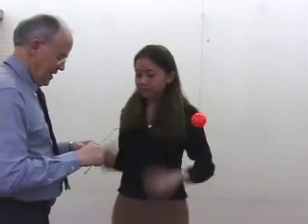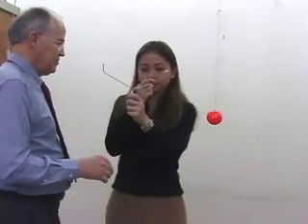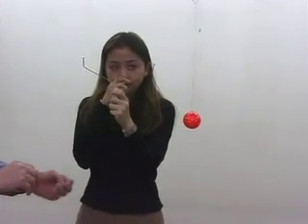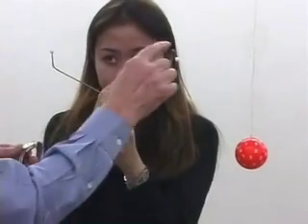Let's do saccadic testing now. Pull that up to your nose. Are we lined up okay? Look over here. I say begin. Roll for 10 seconds. Ready? Begin.